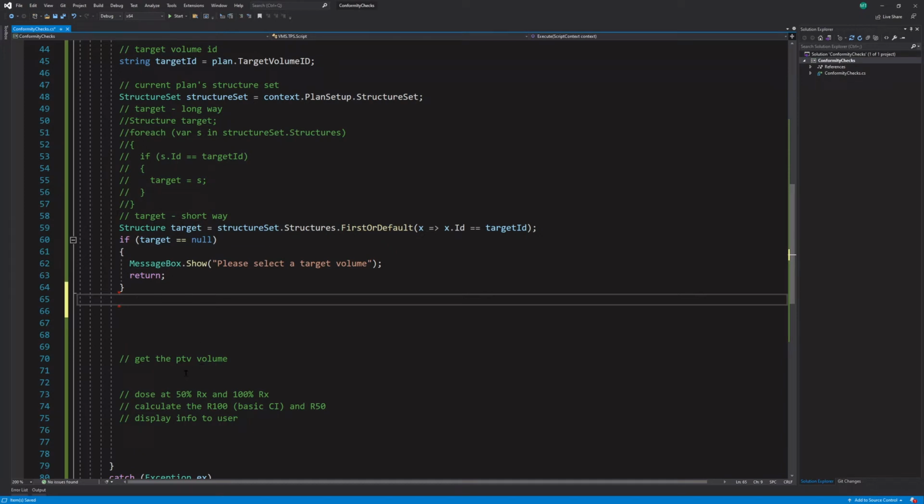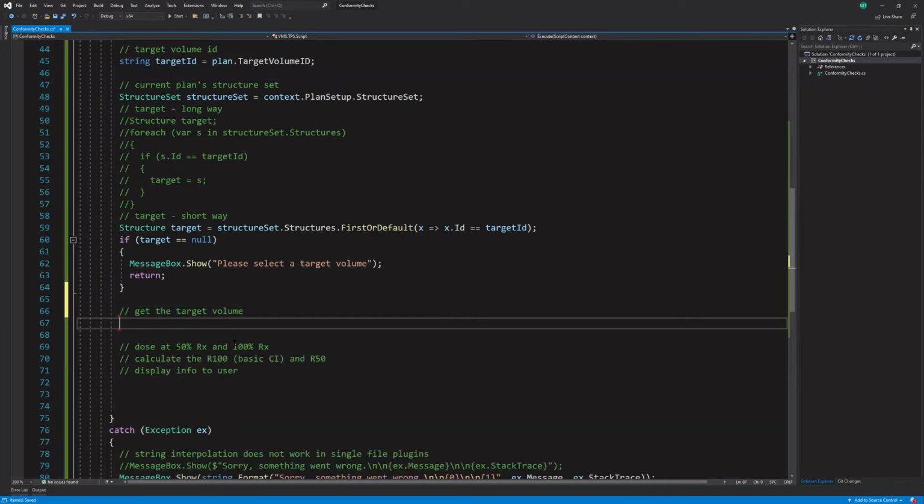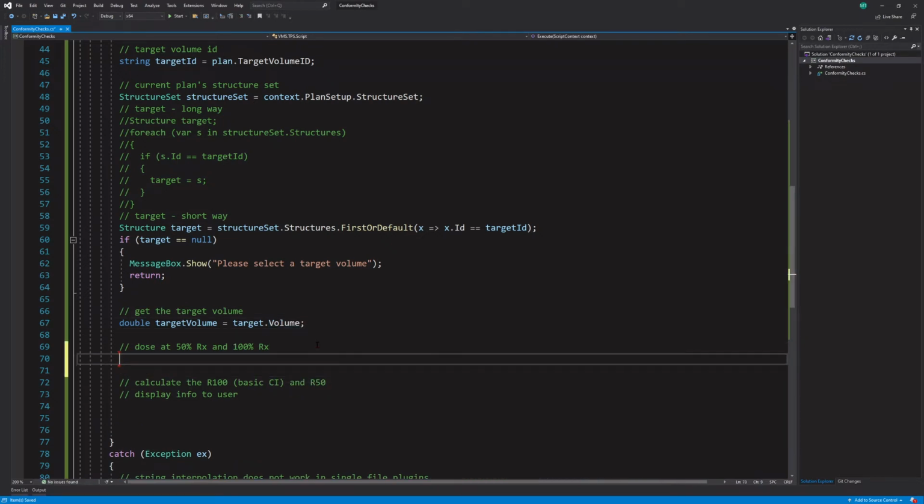Okay, so we've gotten the target, so now we need to get the target volume. Let me delete this, and so double target volume equals target dot volume. All right, and then we need the dose at 50% and 100%. So let's say double dose, let's just call it dose 50% Rx equals, let's see, I might have to think about this for a second. I think, because we need to get the DVH, I think we need the plan get, okay, here we go.